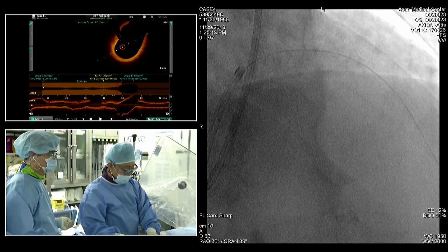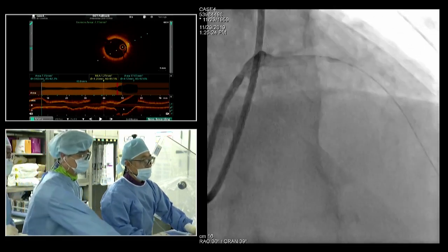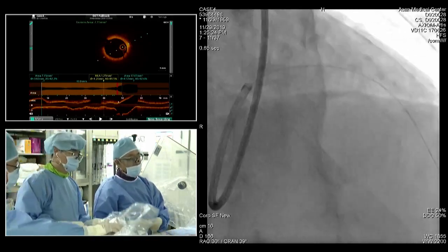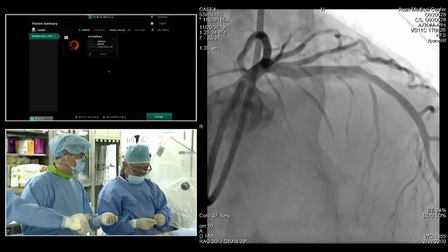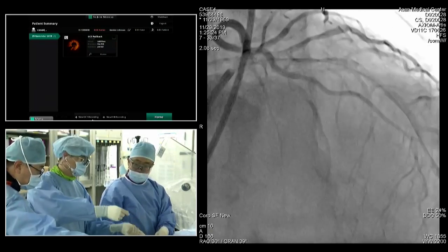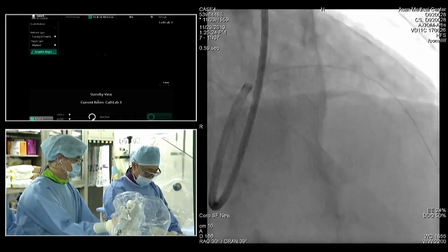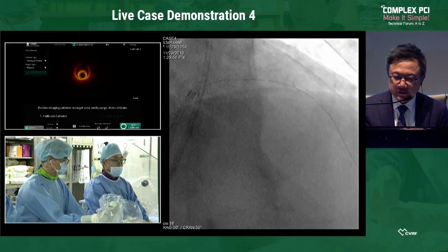What do you think is going to happen to those black boxes now? It probably will disappear within the next year, and probably doesn't matter too much. So at this moment, I'm going to show again the OCT finding, what's happening after balloon angioplasty. Lumen was much improved. And this OCT finding is very helpful to understand the mechanism of the BRS failure. So maybe the intimal plaque and distribution compromised the septal flow a little bit as well.